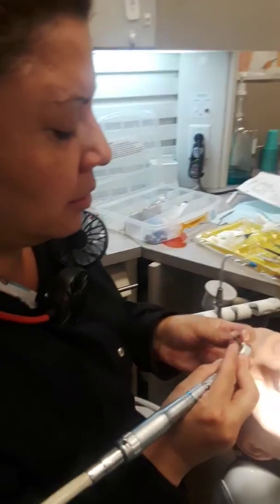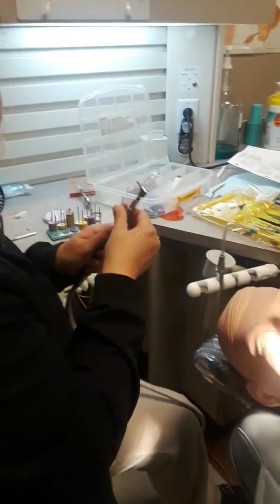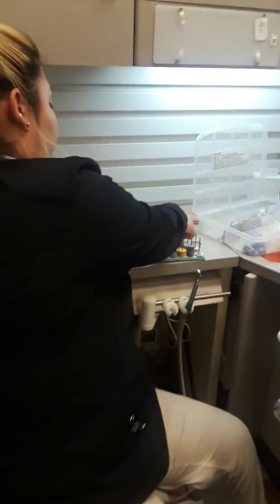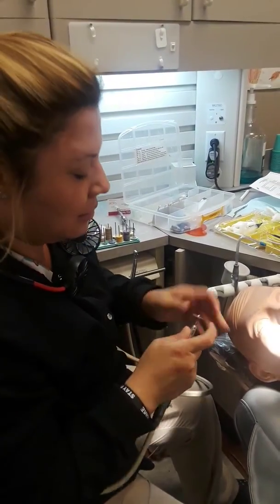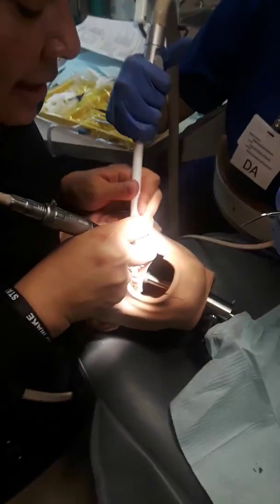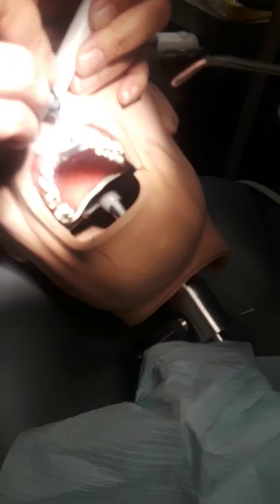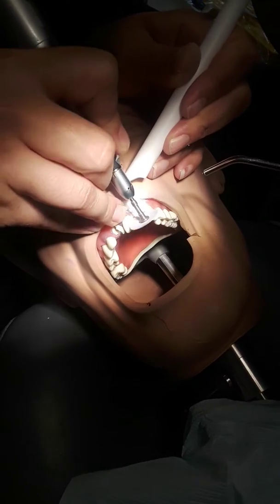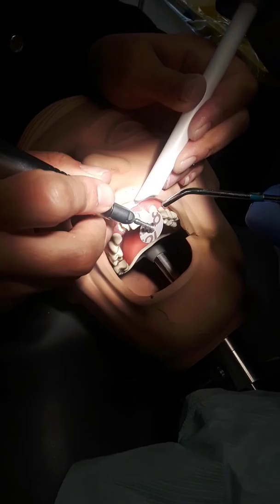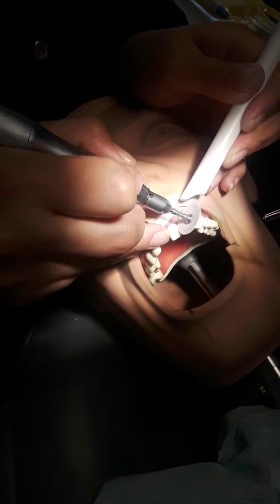How do I know which disc to use? The darker the color the more coarse; the lighter the color the more polish. Retract that lip because I can cut it with this disc — it's flexible, you can see it bending. Facial, facial, facial, lingual only.